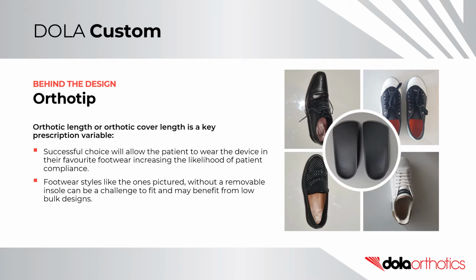Orthotip. Orthotic length or orthotic cover length is a key prescription variable in orthotic design. The successful choice will allow the patient to wear the device in their favourite footwear, increasing the likelihood of patient compliance with their orthotic therapy. Footwear styles like the one pictured, without a removable insole, can be a challenge to fit and may benefit from low bulk designs including a shell length cover.